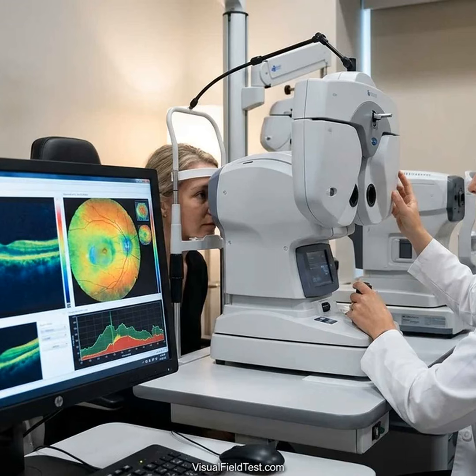Conclusion: Optical coherence tomography is a valuable tool in glaucoma care, but it has limits. In early disease and suspects, OCT is often more sensitive than patient-observed vision loss. It provides precise objective measurements of retinal layers like the RNFL and ganglion cell layer. In moderate glaucoma, changes on OCT, especially thinning over time, are important red flags that often precede or accompany visual field loss. However, OCT is never perfect or complete.